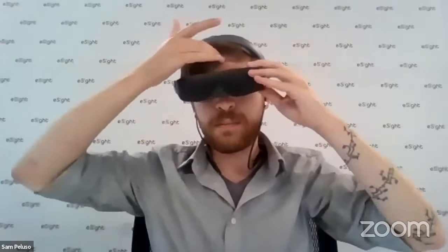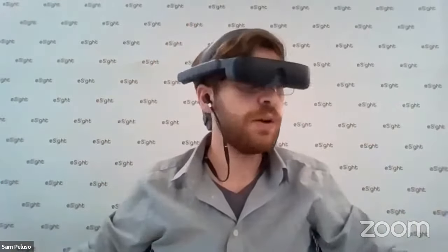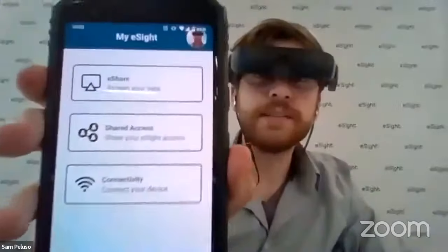Now, if I don't want to carry this around with me, there is a mobile app on the phone that you can download. It looks like this. And with this, I can control everything that the remote can do.